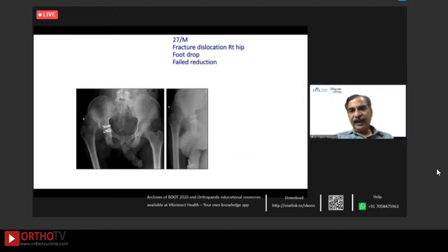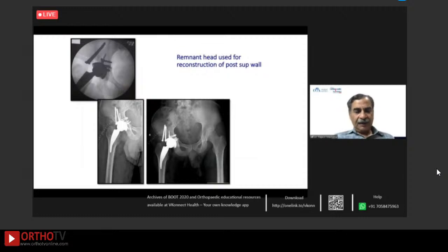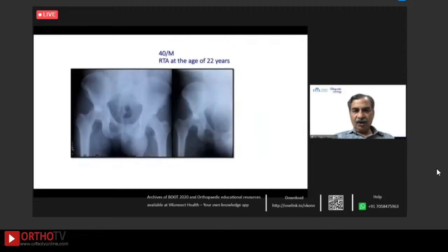A 27-year-old male had a fracture dislocation of right hip with a foot drop. And the remnant head could be used in this case for reconstruction. And this is the follow-up.